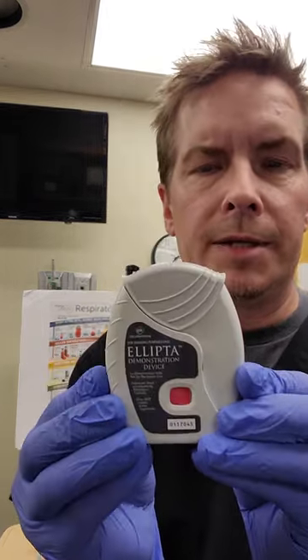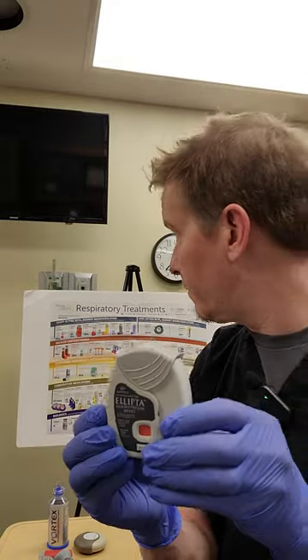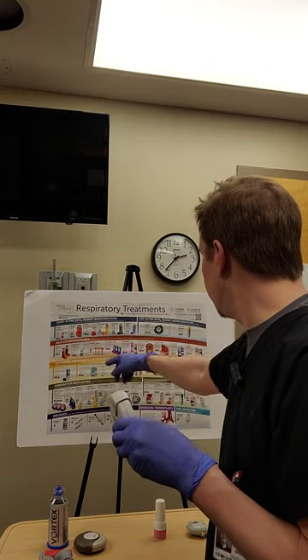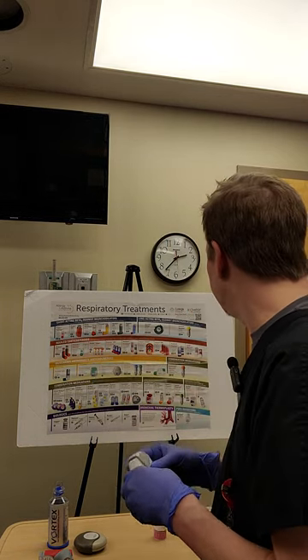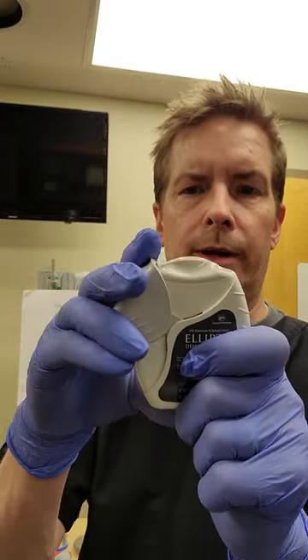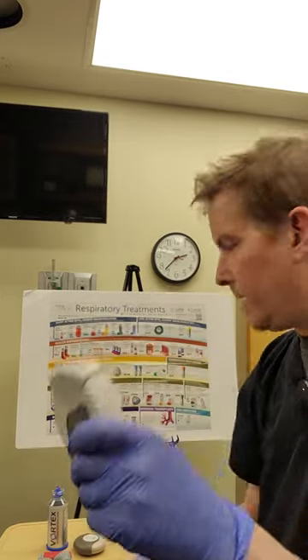This is the Ellipta, and it houses many different types of medications — you'll see in a second: Incruse, Anoro, Breo, Trelegy. Here's how it functions. To open it is actually how you engage it. So we open it — hear the click — the little tablet is crunched and it's ready for the patient right there. Then just close it back up.